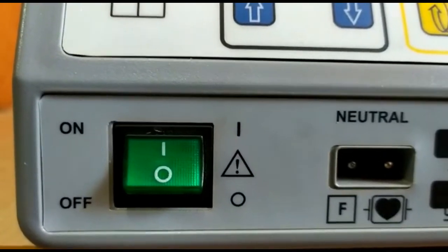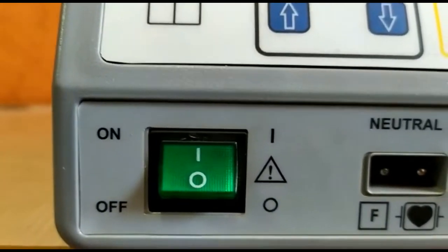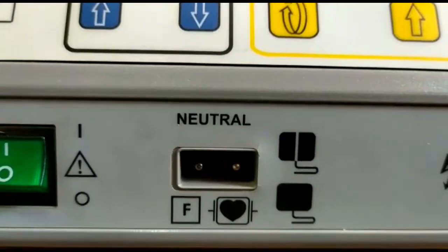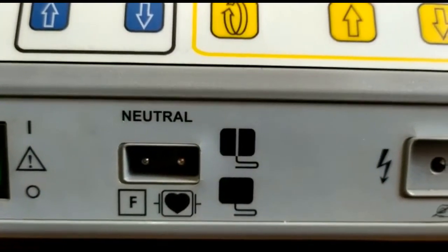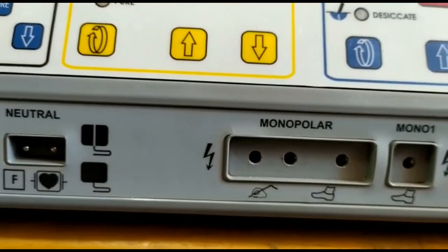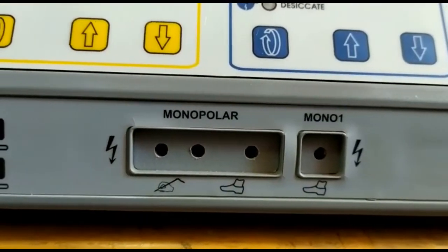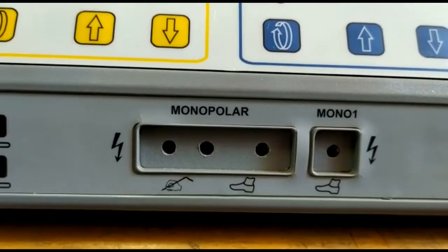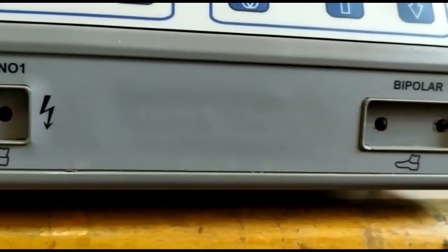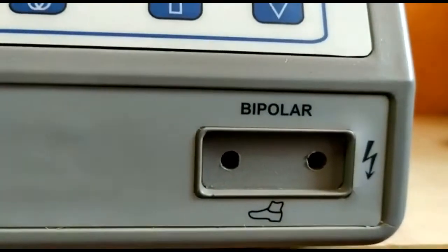The front panel has a power button, and next to that you have the patient plate socket. We recommend a split patient plate, either disposable or silicone. There is a 3-pin socket for a monopolar pencil and a single-pin socket for laparoscopic or urology procedures. There is also a bipolar socket on the front panel.